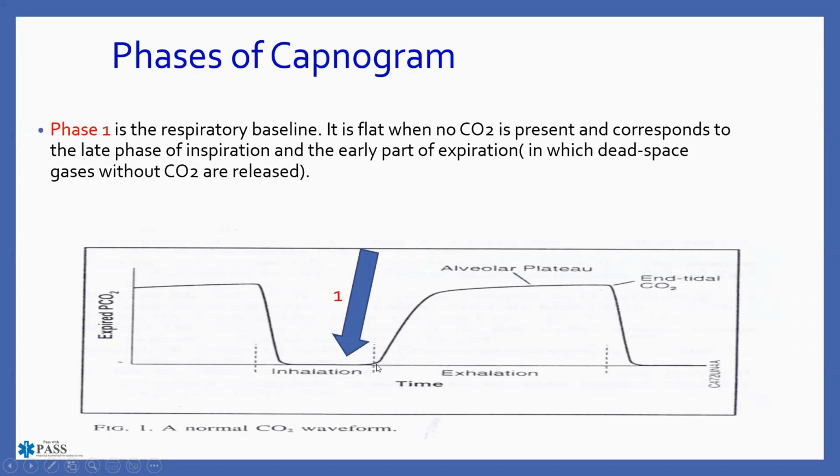If they're exhaling very quickly, then this waveform is going to have a much different look. Maybe it ends over here, or maybe it ends over here, etc. If it is taking them longer to exhale, then obviously that waveform doesn't stop here. It is extended over further because, again, left to right, we're talking about time.